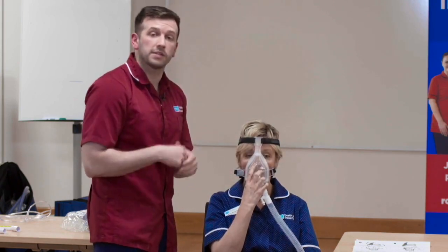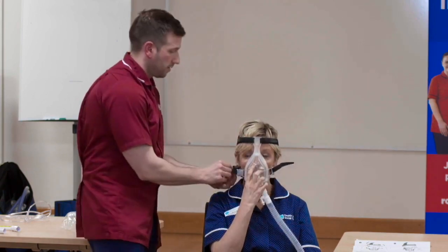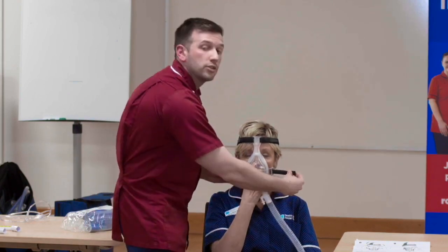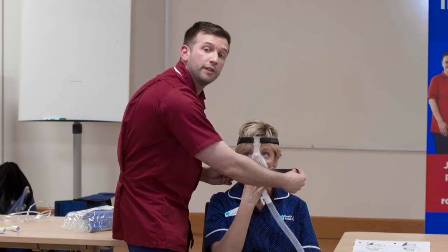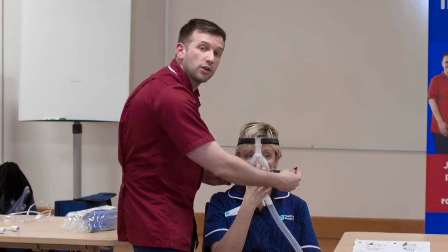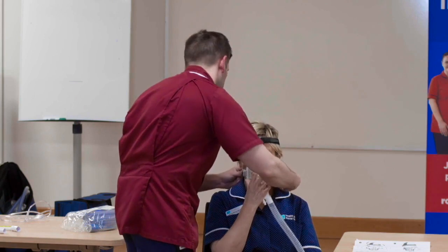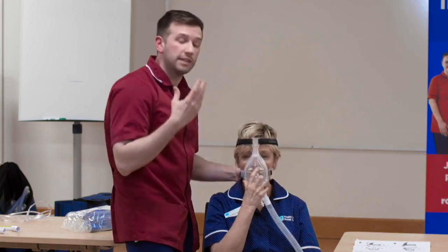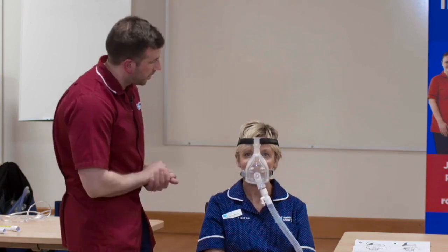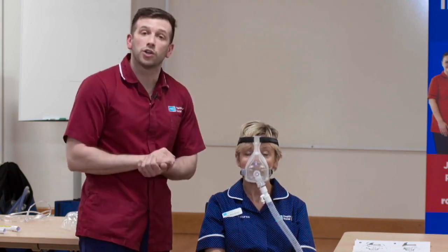Next, I will do the same process on the lower straps. At this point, coach and reassure your patient that it will feel tight. When we talk about tightness of a mask, we don't want it to be too tight to cause pressure damage or cause discomfort to your patient. As your patient releases the mask, they should feel the mask spring back slightly from the face. How's that, Anne-Marie? At this point, it can be good to do something we call the toggle test.